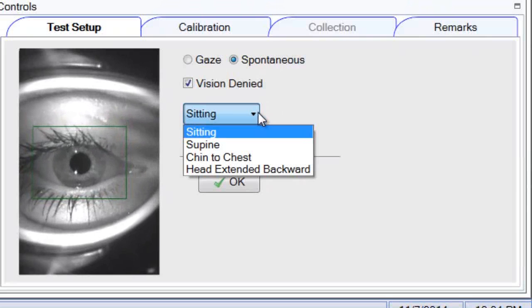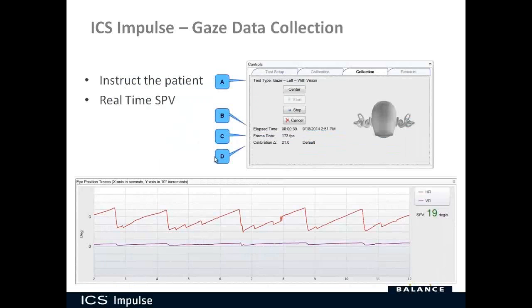During data collection, first instruct the patient and tell them what you're going to have them do. If you're using head position feedback, center the head and then ask them to look left or right — you can tell if the head is moving from the head position feedback. Start the test, and you can stop it manually or set the desired duration in test options so it automatically stops and goes to analysis once that time is met.